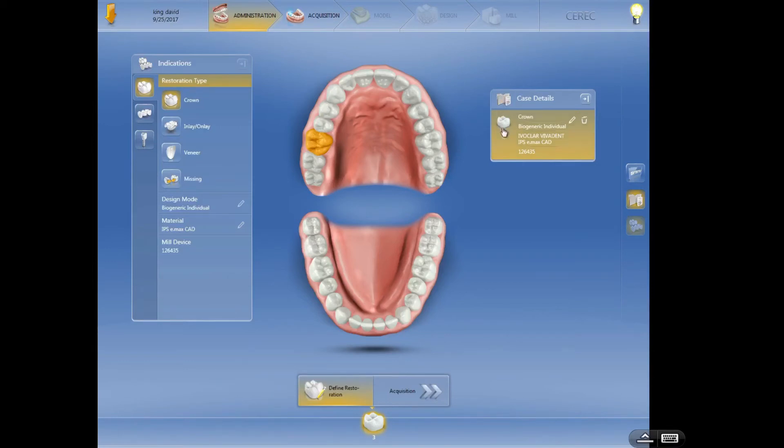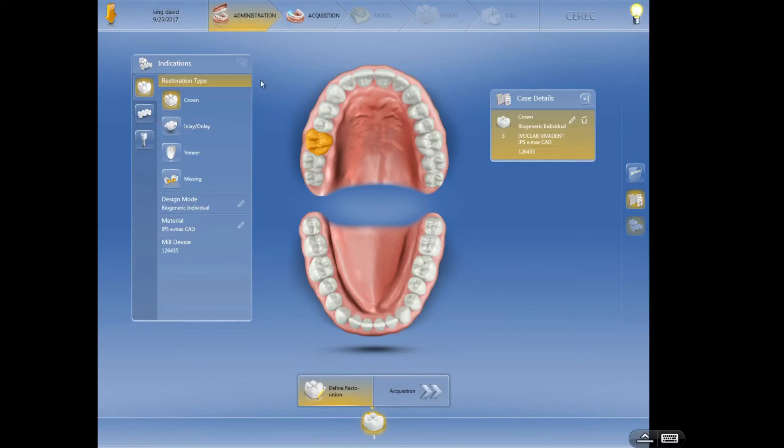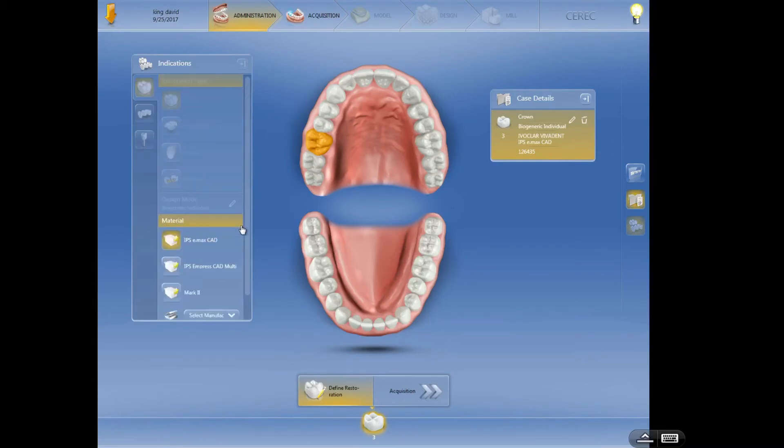Now let's say I wanted to use something different for tooth number four. Well if I was going to do a crown on number four, I'd leave the settings the same for crown, biogeneric individual, but I could change this now to say I wanted to use a mark two or an empress or a CEREC smart or whatever you want to use.